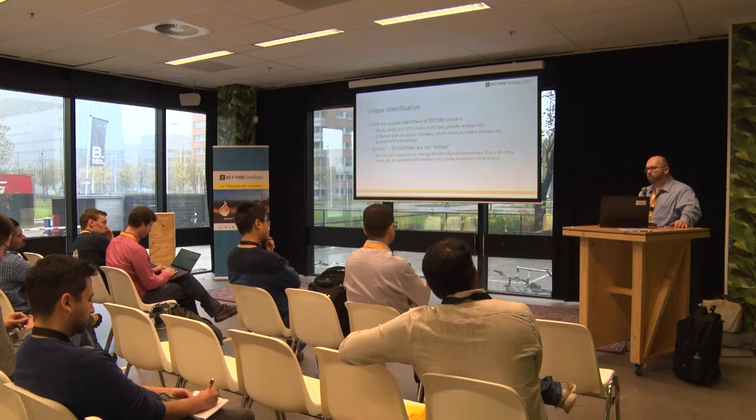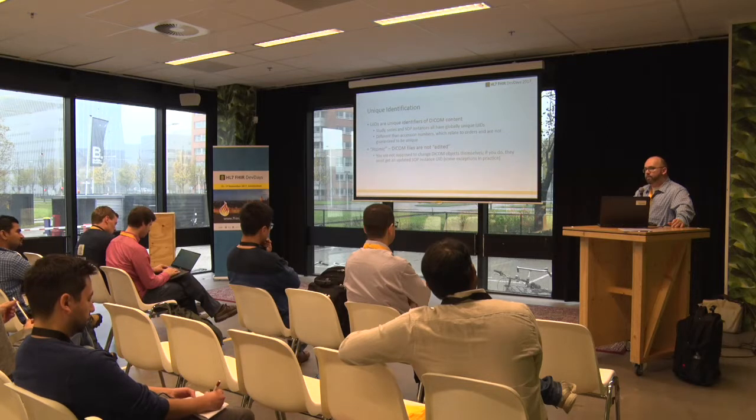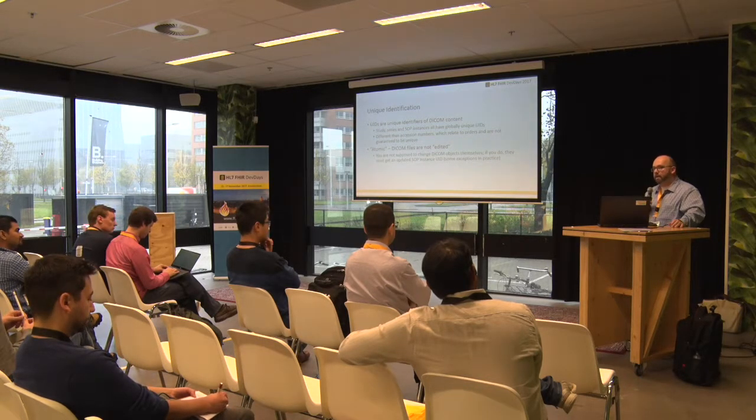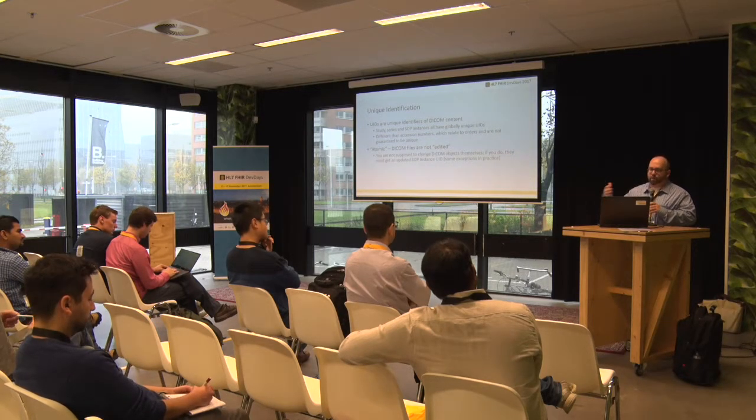But the EMRs don't usually store the images themselves because they can become quite large. You think about an EMR is really good at storing discrete data in a database, that are maybe a kilobyte or two kilobytes. When we talk about a pathology whole slide image, we're talking about half a terabyte. And databases aren't typically well structured for that if they're geared towards this relational type of database.